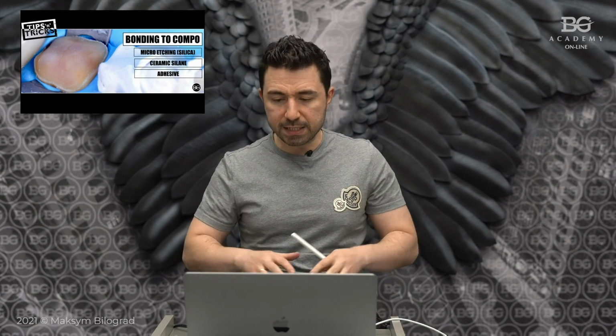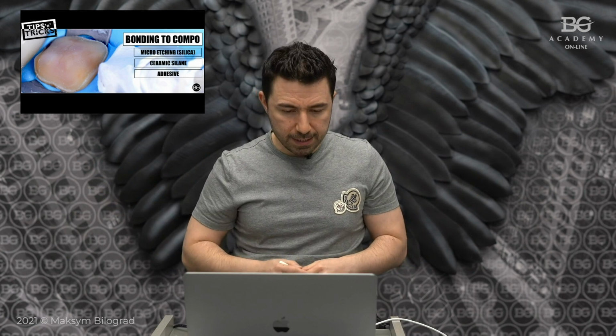Okay, so you sandblast. Then you may use ceramic primer or ceramic silane on the surface of the composite, and that will give you some chemical adhesion to glass particles that are in the composite. And then you can get also chemical adhesion to monomers that will come from the resin cement, and then you bond actually everything.